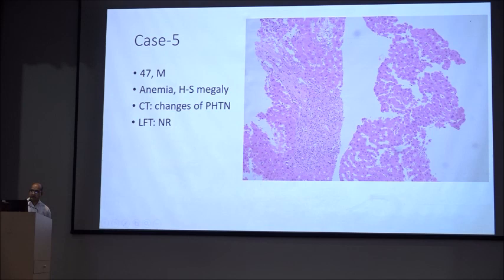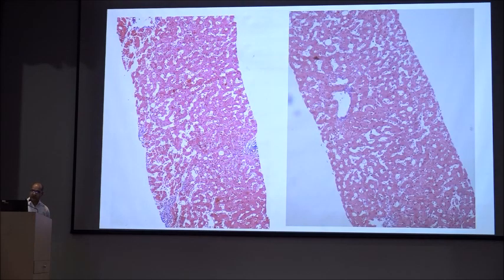And the sinusoids here, unlike the other cases which we saw, they are a bit dilated, and they are profusely dilated across the liver parenchyma, and they are not showing any zonal distribution. So non-zonal sinusoidal dilatation here. This is another case also showing non-zonal dilatation and atretic portal tract. This is a similar case which is also showing non-zonal sinusoidal dilatation. So diagnosis in this case is megasinusoids.